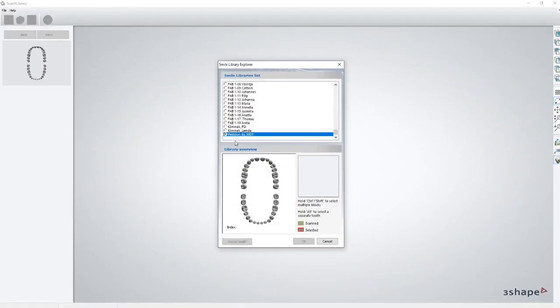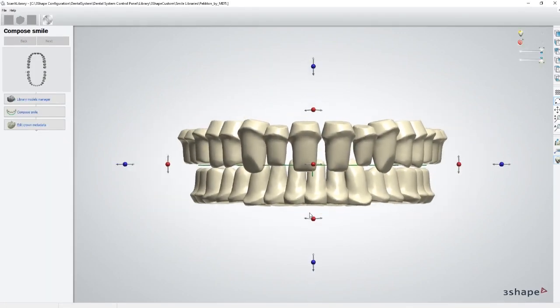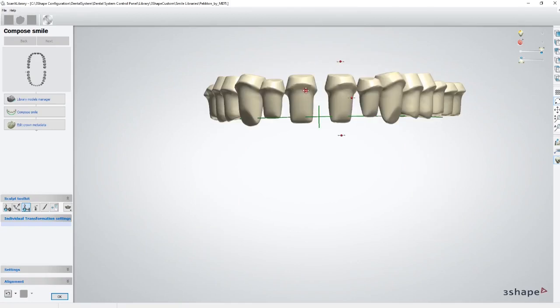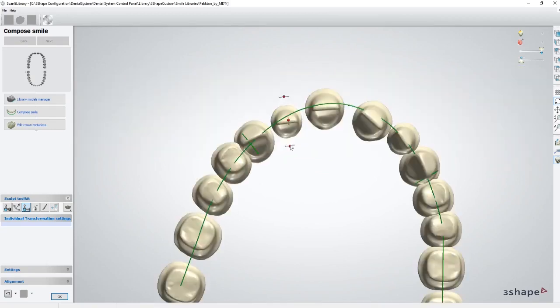I have to select the library which we created, which is Pekkton by MDT, and select all teeth because we're going to make it as a full arch. Click on import teeth and go to the path where all these DCM files are. So the smile is getting loaded and now I can adjust it. I usually use this green line and position all my teeth first. I can raise them, I can rotate them a little bit to make them fit this line.